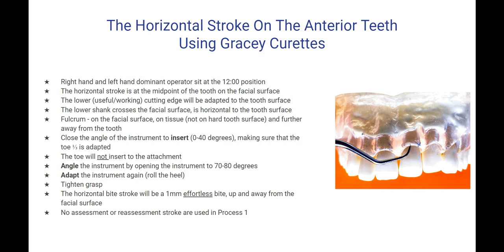The fulcrum is on the facial surface, on tissue, not on hard tooth surface, and further away from the tooth. This will be a new experience for you because we've had you keep your fulcrums very close and on hard tooth surface. Now we're asking you to fulcrum on the tissue and further away.